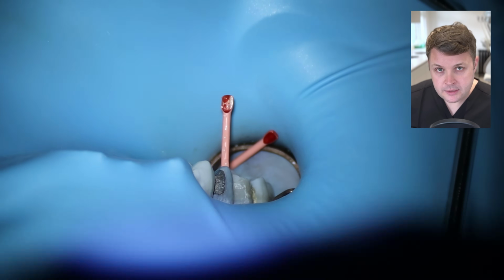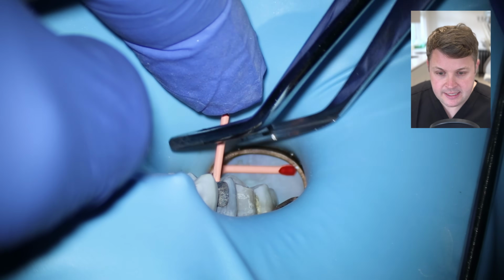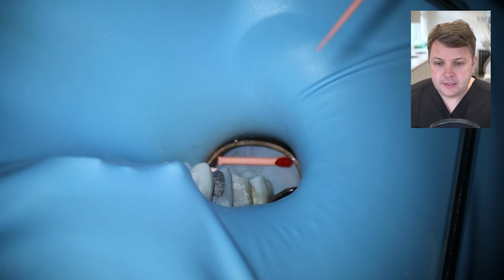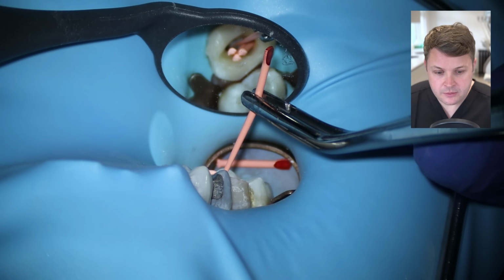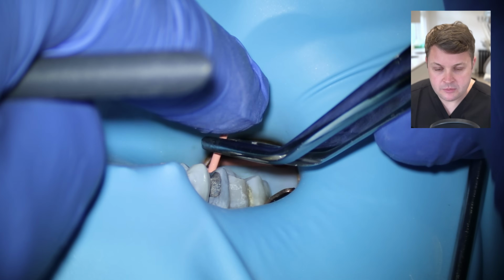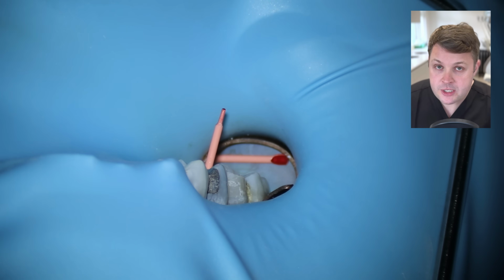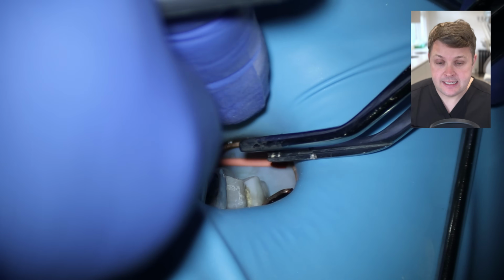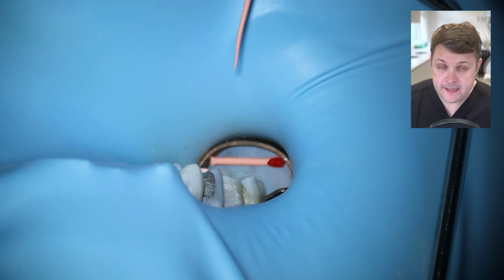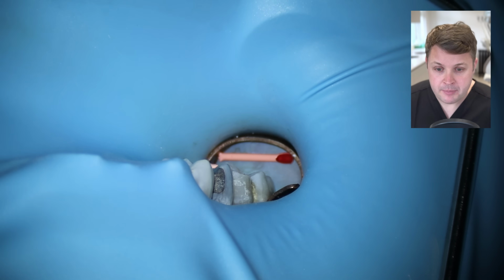The MB1, the MB2 and the DB cones all go really nicely to length. However, when we do our cone fit of the palatal, what you notice is that as I push this palatal cone to length, and I've obviously crimped the GP cone, it pushes past that crimp point, indicating that the apical diameter of the GP cone doesn't match the apical diameter of the palatal canal.